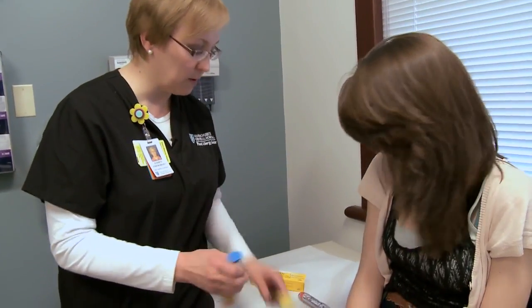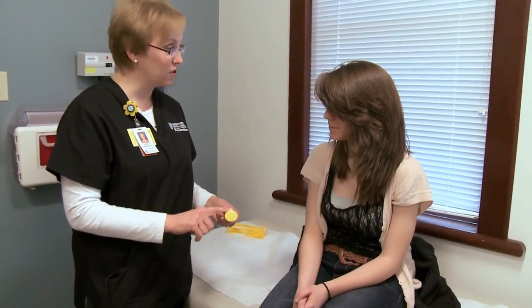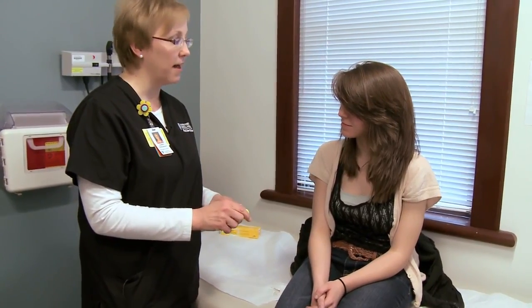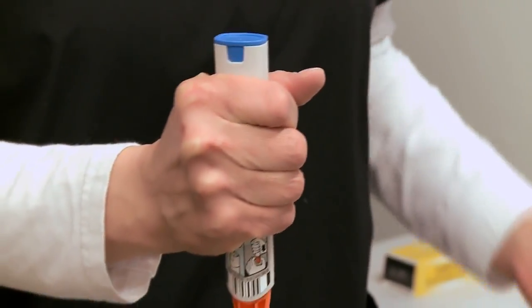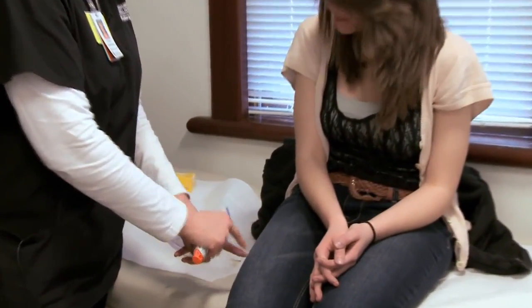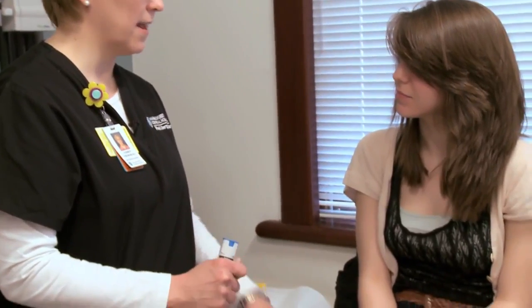We're going to put the real one away and practice with the trainer. Have the patient slide it out into their hand like a fist and never change that position. It's going to go anywhere in your outer thigh and it's made to go through clothing, including jeans, if you have to. If you can administer it directly into the skin, that's ideal — you'll be confident everything is done correctly. But if you can't remove clothing, go ahead and administer it through.